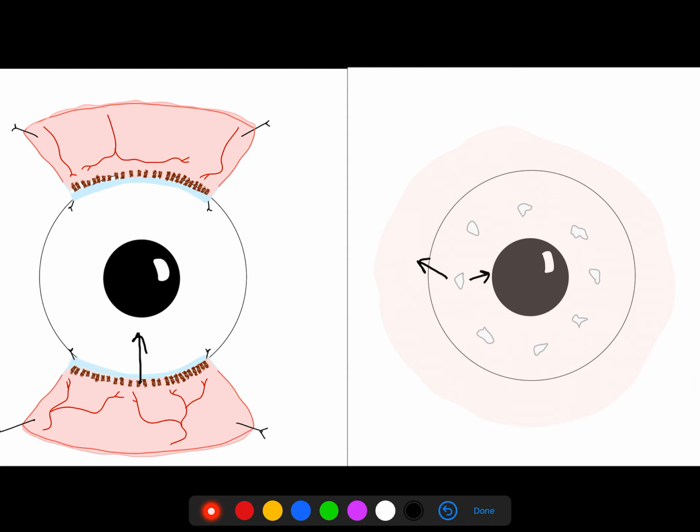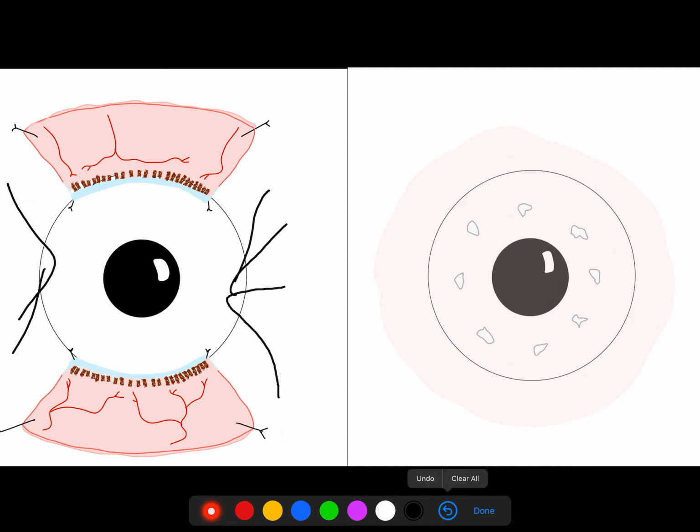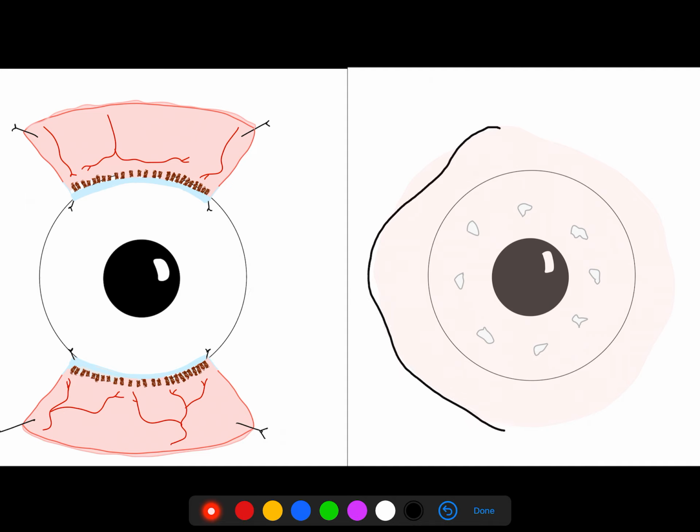In CLAU, while the limbal graft prevents the conjunctiva from moving in any further, there is no protection medially and laterally. And if you've seen outcomes of conjunctival grafts, you will see that many of these eventually heal with a pseudopterygium that comes in medially or laterally. Okay, and that is because it does not provide any protection in these directions. Whereas because of the use of the amniotic membrane in SLET, it provides 360-degree protection against the conjunctiva coming in till the surface has been completely epithelialized by the cornea.